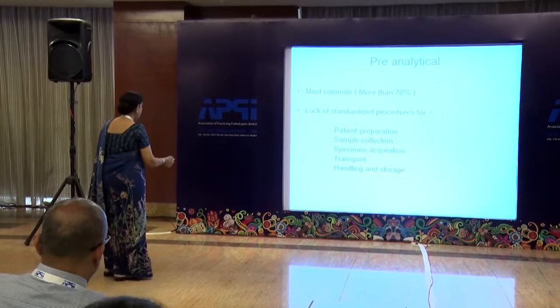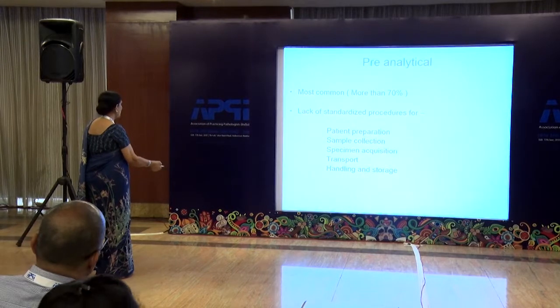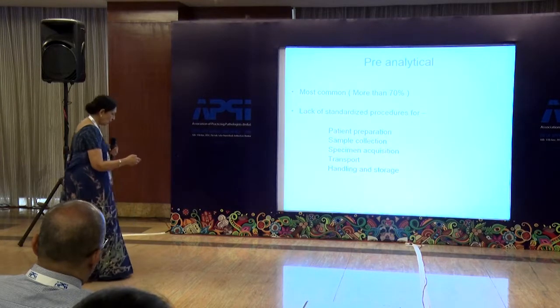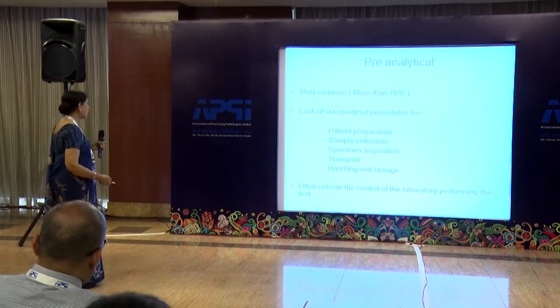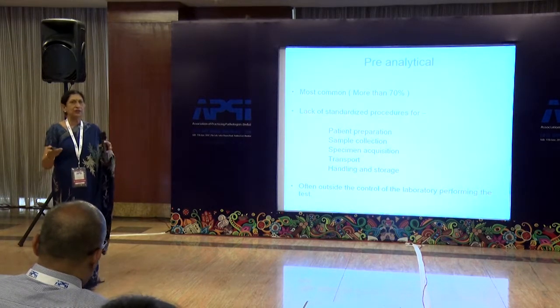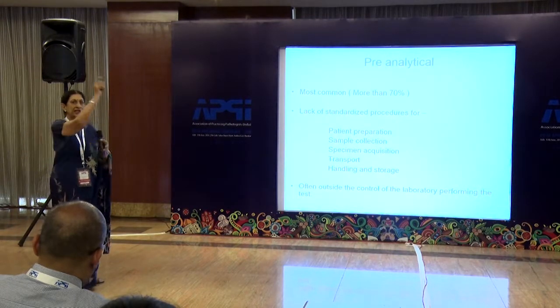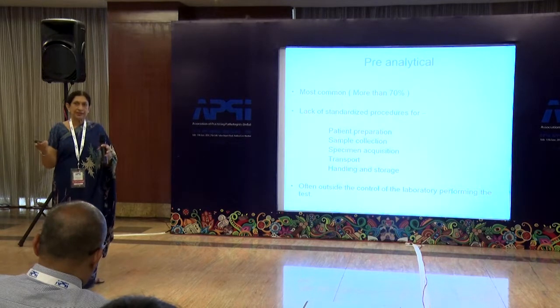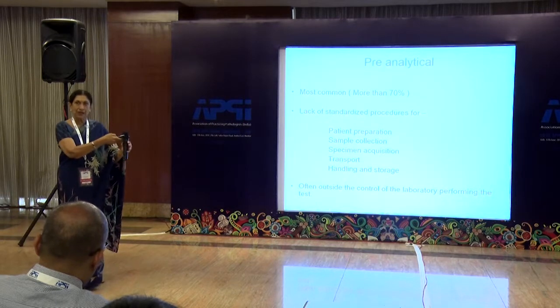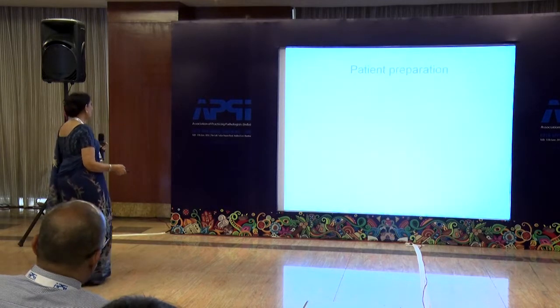You can see that patient preparation is very important: how you collect the sample, how you acquire, transport, handle and store your specimens. Often, as I said, it is outside the control of many laboratories. They just take it, centrifuge it, take out the plasma, and send it away. You don't know what's happening to it. We have had 40 degrees centigrade outside. Is your transportation proper to go to that reference lab? So better to say no or do it properly.